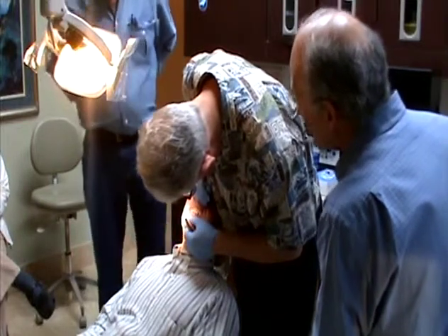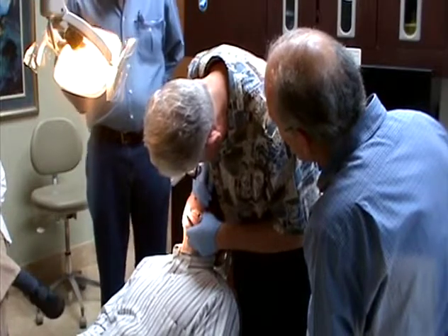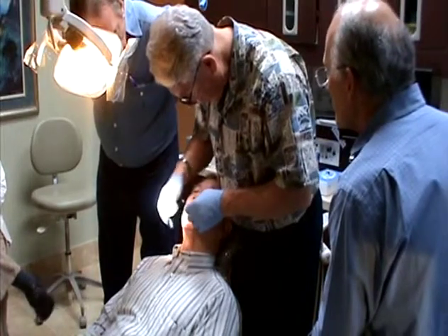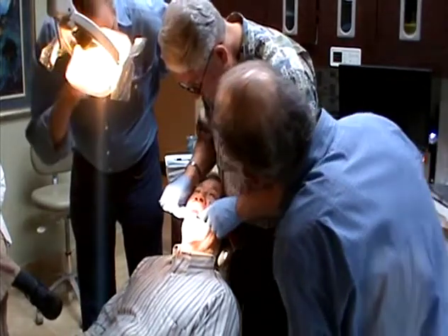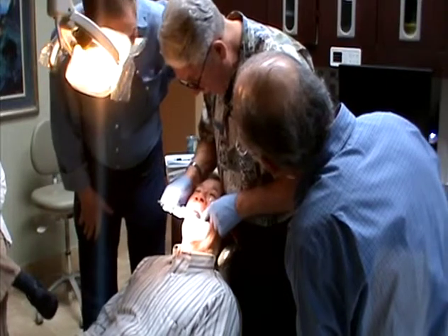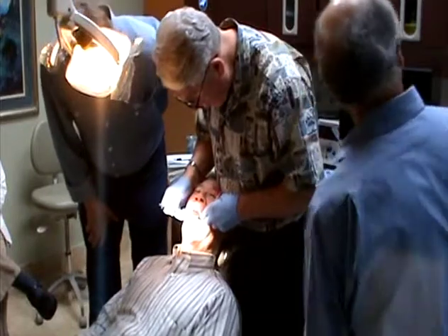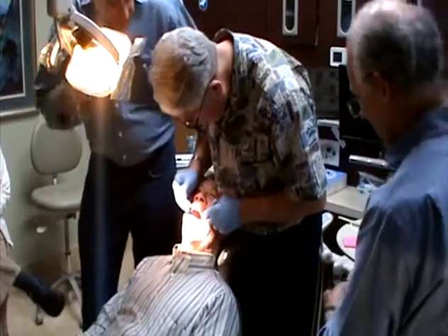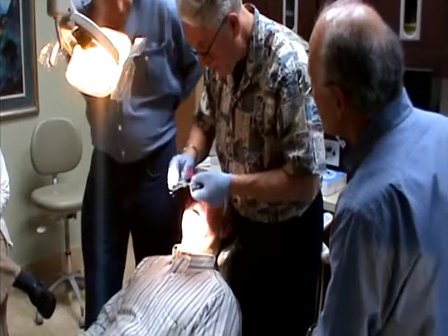Right now, slide to the left. You've got an interference right here when you slide to the left. Yeah, he's got one right back here. He's got one right there. See if that's across too.